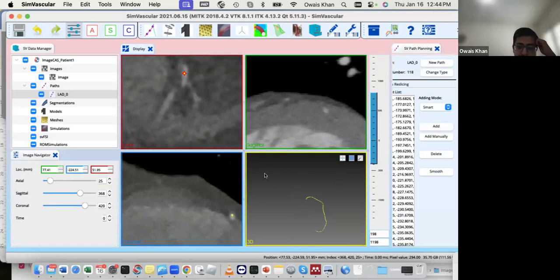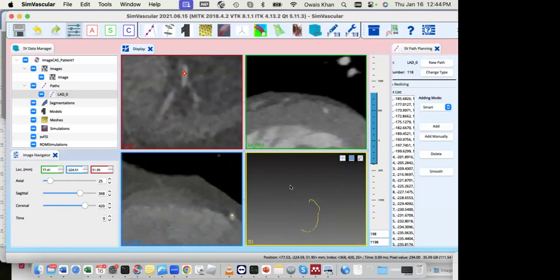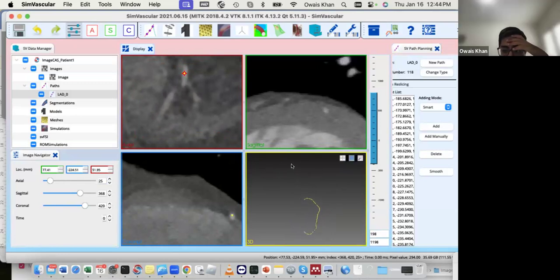Is it one of the Japanese ones? No, this is an open source data set. Oh, it's really good. The Japanese data had such a resolution. Yeah. So this is pretty good.